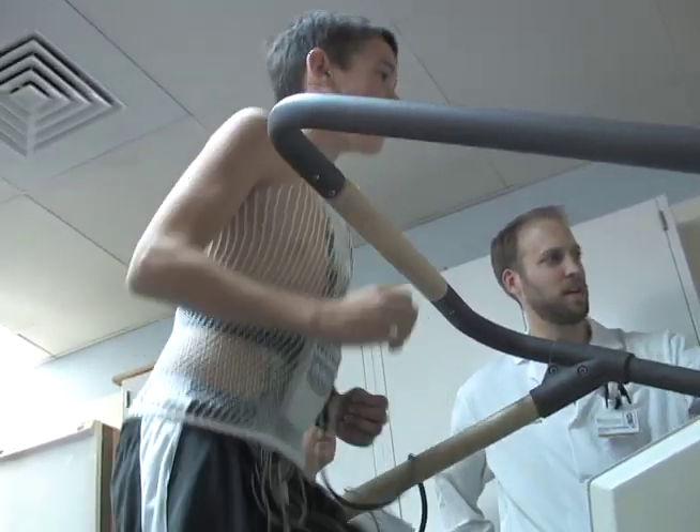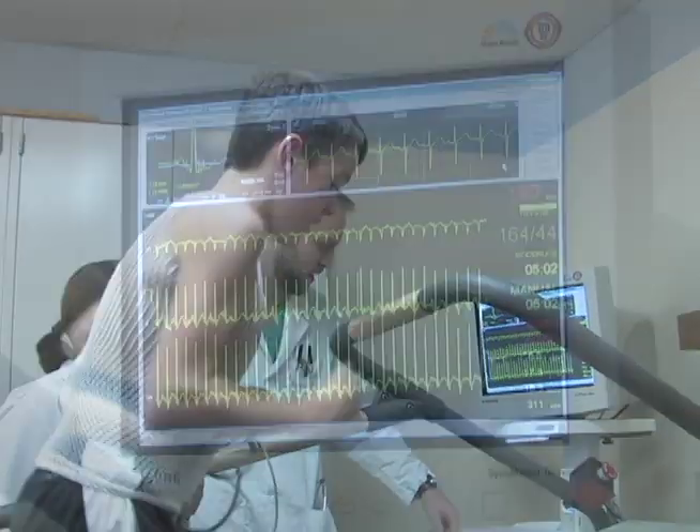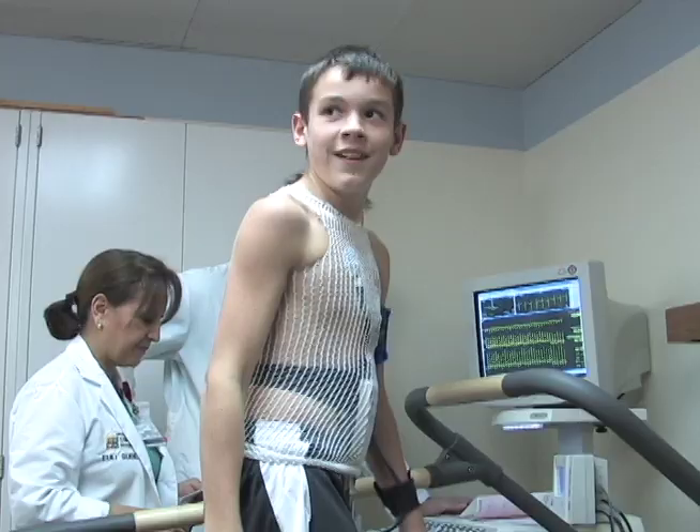The treadmill initially starts slowly, and then gradually increases in both speed and incline to provide a challenging run. This test continues until the patient is tired, has reached a preset goal, or has specific findings or indications on the test.